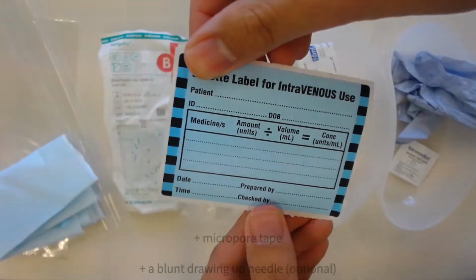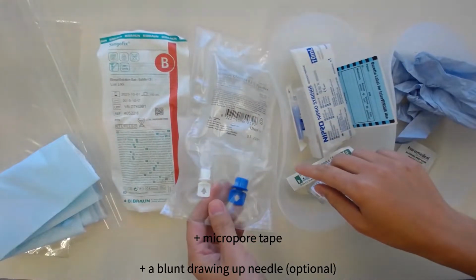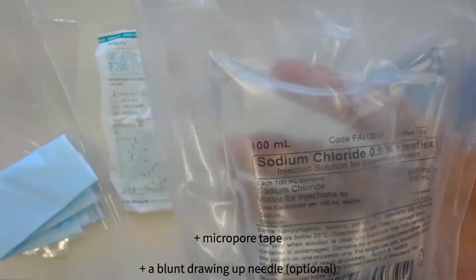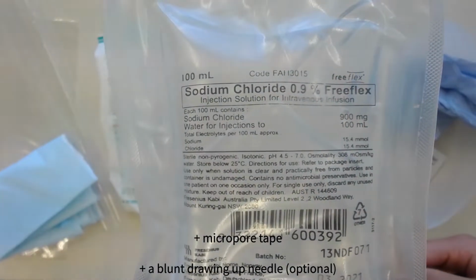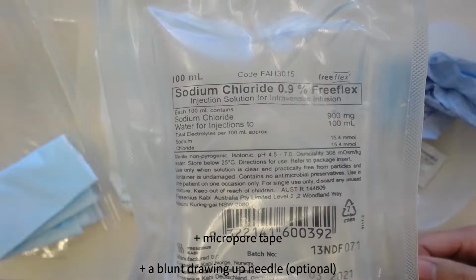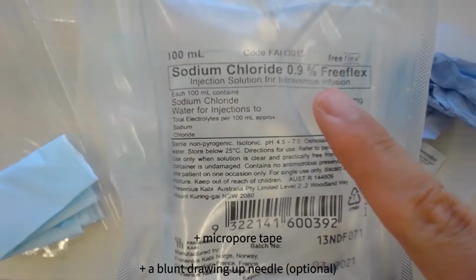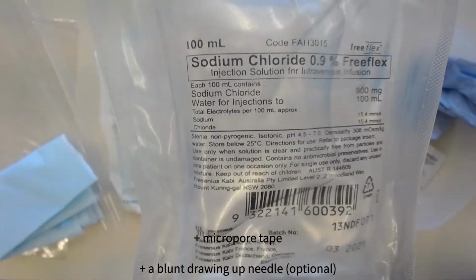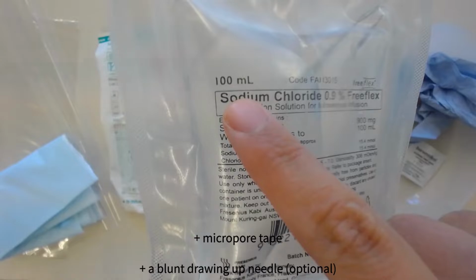I've also got my bag of IV fluids. It's a 100 milliliter bag of sodium chloride, 0.9%, also known as normal saline. You can also see here on the bag it says injection solution for intravenous infusion, 100 milliliters. And all the way at the bottom has the expiry date.